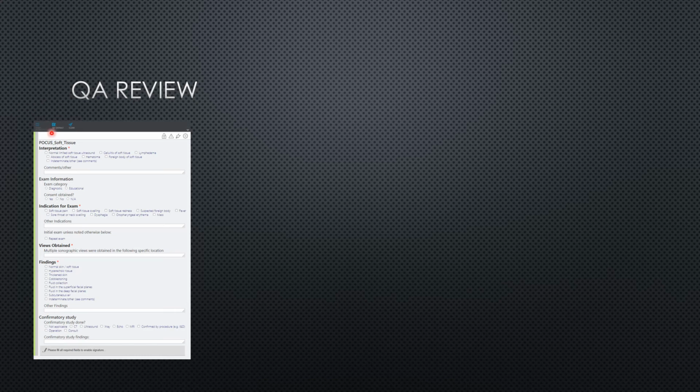We also have the set default option. In the near future, I'm actually going to have defaults for pretty much every exam indication. There may be exceptions. The soft tissue is going to be one of the exceptions because we often do it because we think there's cellulitis and we're looking for an abscess. So that really doesn't make as much sense for me to set defaults on.